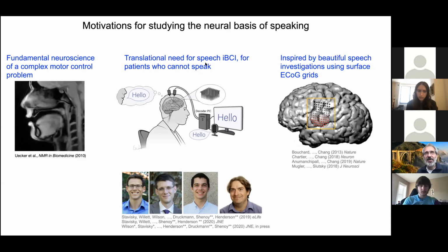Now, how is this possible? Well, we did not go put electrode arrays in IFC or Broca's area, okay? We had arrays and we were opportunistic. We had them sitting right here in, this is an artist rendition, so it's not super accurate, but it was sitting in hand knob area, the exact same array locations as before. So it really should be far more lateral or ventral before you get to speech areas.